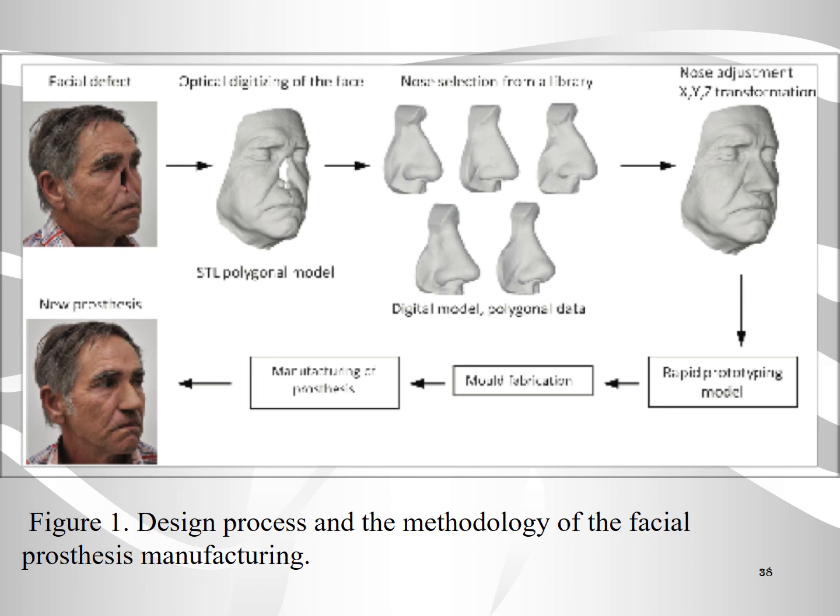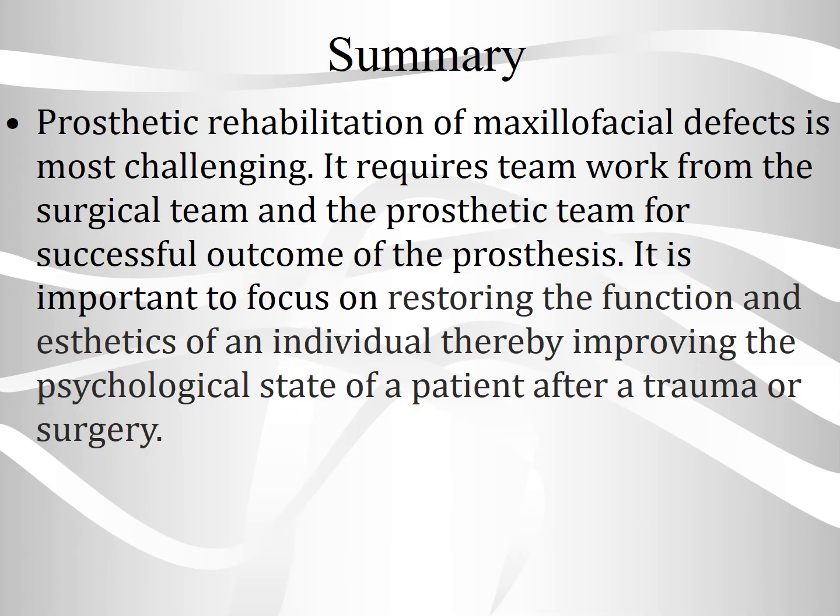Then comes the mold fabrication. Then comes the manufacturing of the silicone prosthesis. And the last photo is the final fitting of the patient's face. So these are the basic design process and the methodology of the facial prosthesis manufacturing.